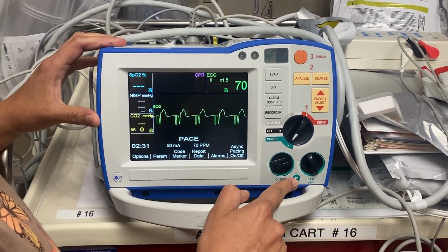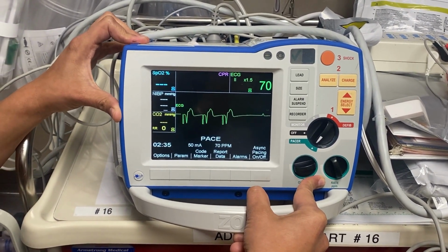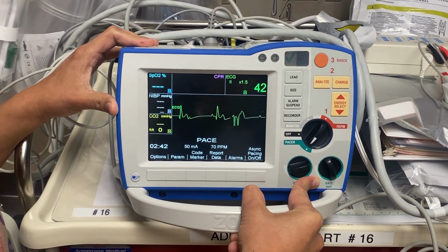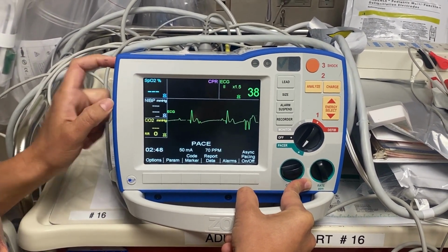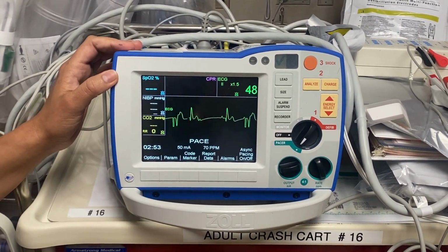You see this button, 4 to 1. When you press and hold this button, it's going to show you the baseline rhythm of the patient without losing the capture. So if the doctor walks in and wants to see the baseline rhythm of the patient, you don't need to go down on the milliamps to show them the rhythm. You can just press and hold this button and you can see the baseline rhythm, and let go of it and you will see your capture again.